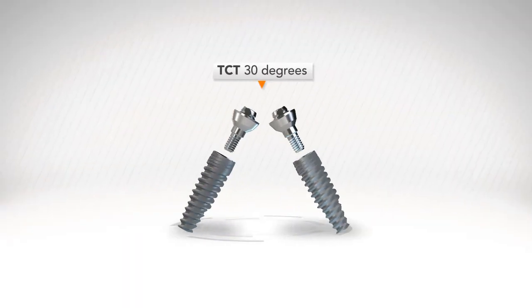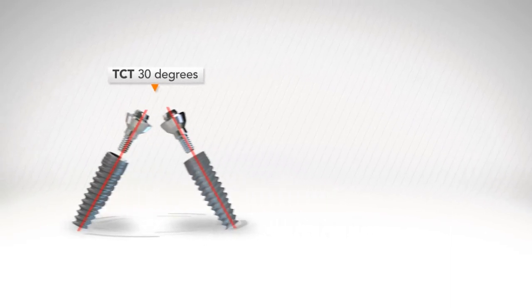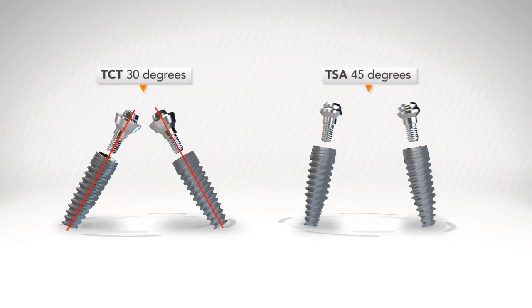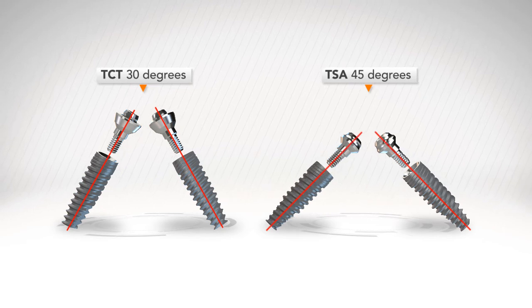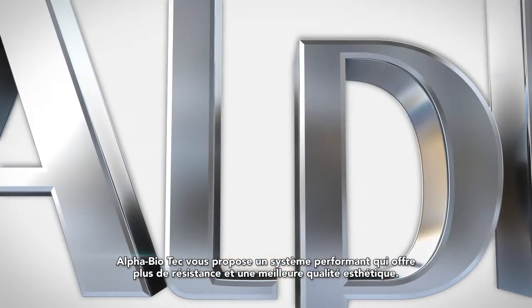Our screw retained line contains TCT parts that enable restoration on implants up to 30 degrees. It also contains TSA parts that enable restoration on implants up to 45 degrees. The procedure with the TSA is the same as with the TCT — an improved system for extra strength and better aesthetics from Alpha Biotech.